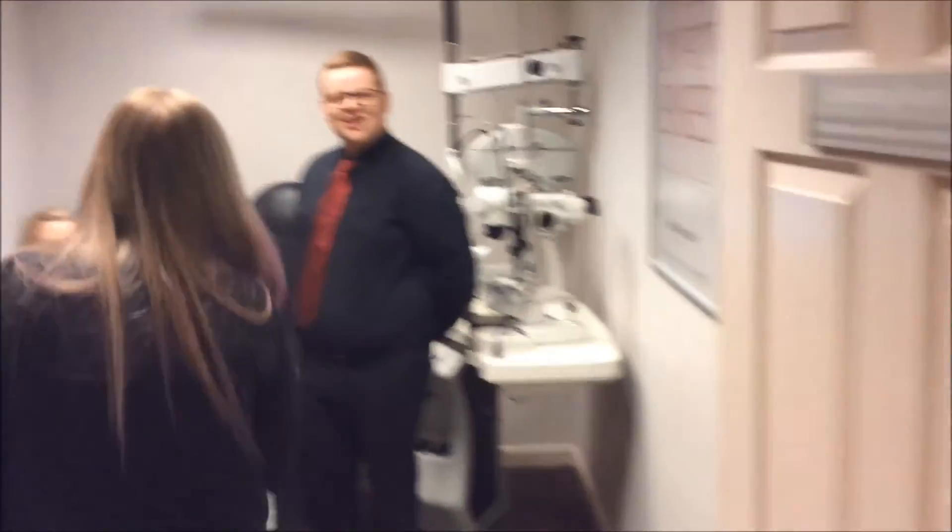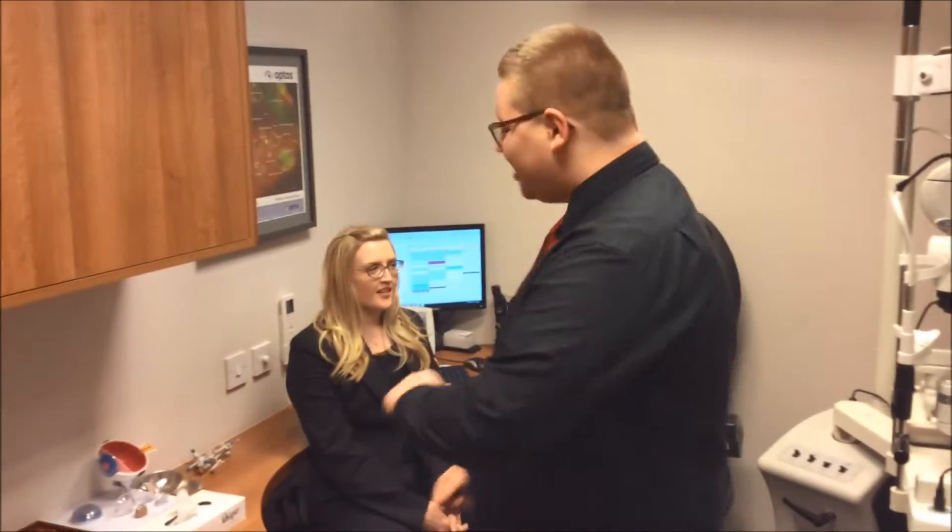Hi and welcome back to Black & Lizars. Today we're going to be taking you through what goes on in our test room. Hi guys, this is Gillian, she's one of our optometrists here. What we're going to do is Gillian is going to go over some of the equipment that we've got in store and what it's used for. Over to Gillian.